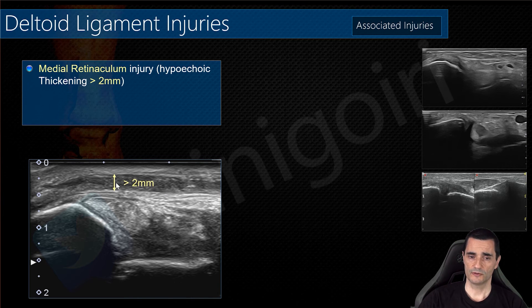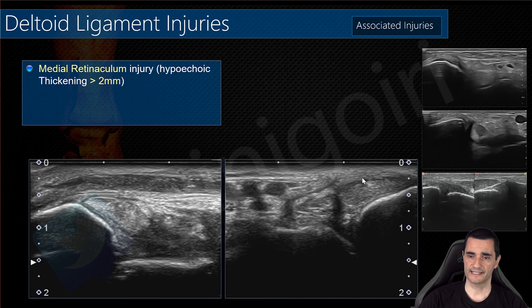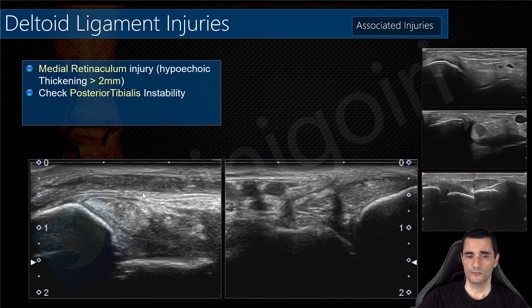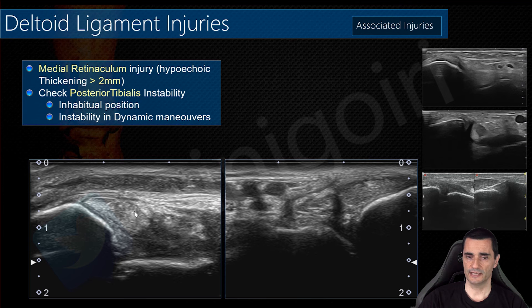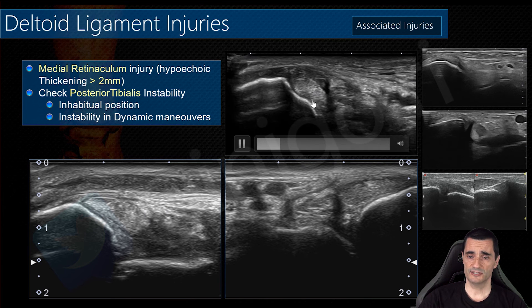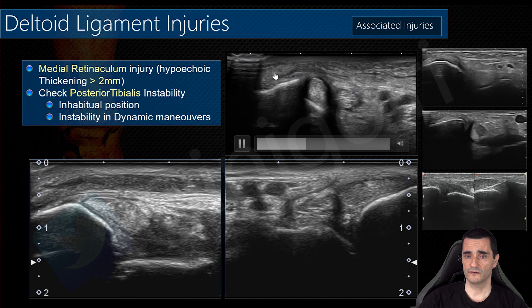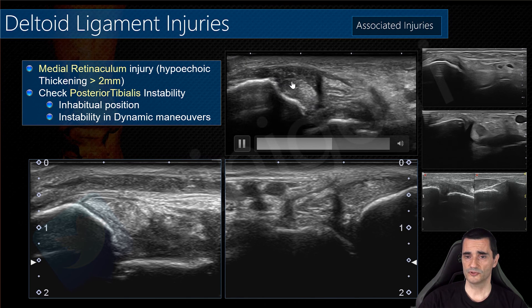You can measure the thickness or compare with the contralateral side — this is the normal contralateral side with a very thin retinaculum, in contrast to a torn retinaculum measuring more than two millimeters. It is important when affected because you must always check for posterior tibialis instability. If the posterior tibialis is not in its normal location, or with dynamic maneuvers it gets luxated, we will find instability of the posterior tibialis tendon.